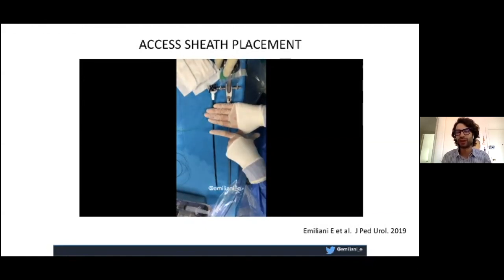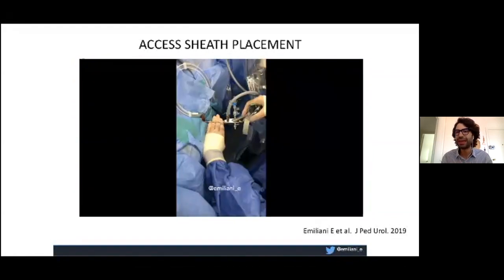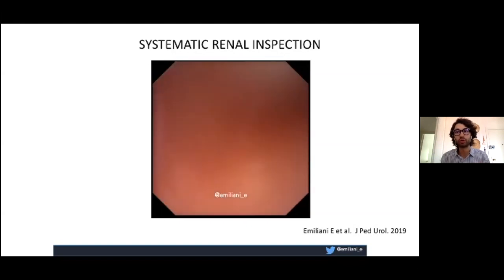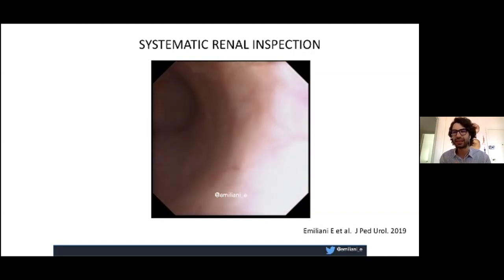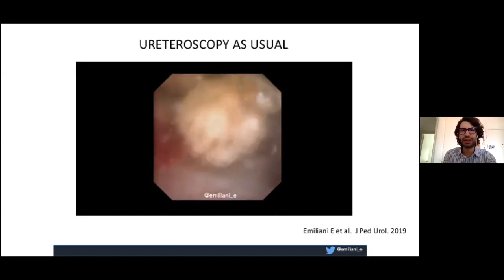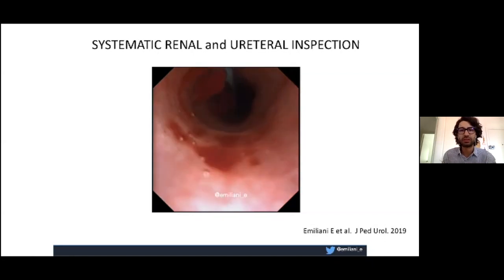Check the kidney systematically from the upper to the lower calyx, since you won't be doing any fluoroscopy. Do this at both the beginning and end of the procedure. Then perform the ureteroscopy as usual — you don't need fluoroscopy for this. Afterward, check systematically again from the upper to the lower pole and then the ureter, to confirm no damage has been done and no stones have been left behind.